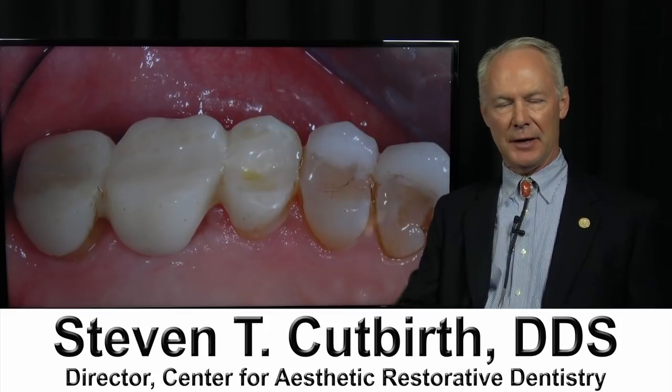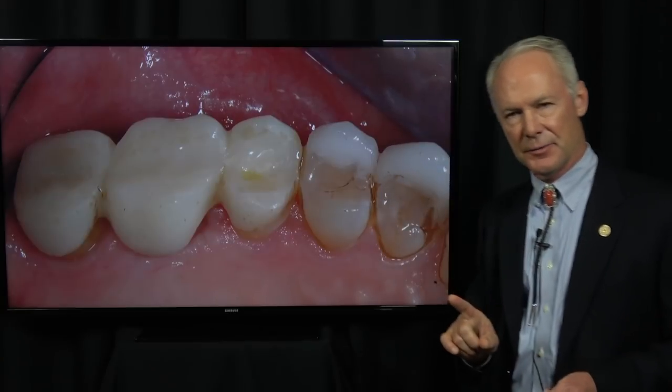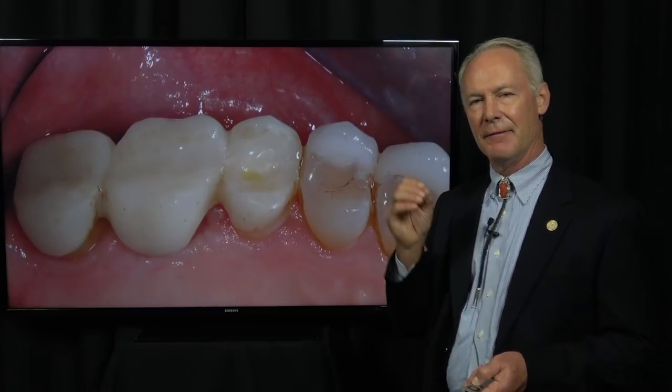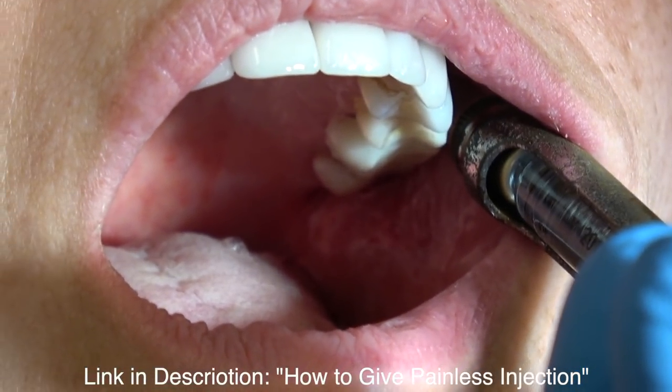The patient is returning to place the final fixed bridge. The final fixed bridge is not a random thing, and I'm going to give you some very important points with regard to the seating and the fabrication of the final fixed bridge. So: anesthesia, then removal.